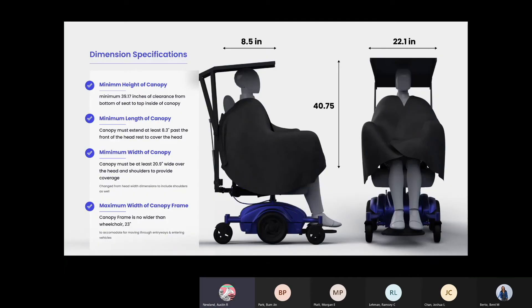The canopy must meet certain dimensional requirements to cover the user. Our design has sufficient body clearance and coverage to cover the user, while remaining small enough to fit inside small spaces such as public transit.